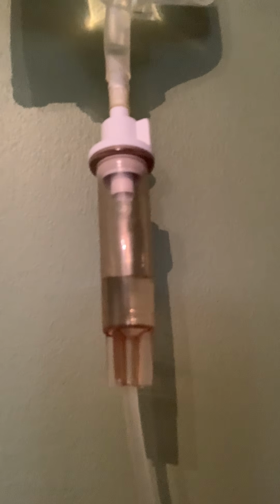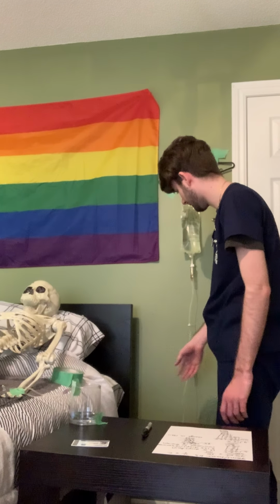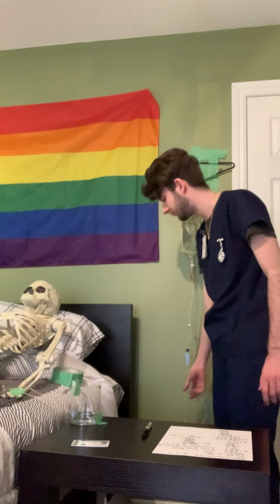I'm going to check the patency of the tubing all the way from the bag to the patient, making sure all the clamps are unlocked and that there are no air bubbles or any kinks or occlusions in the tubing. I'm also going to state the TBA, which is when the bag needs to be changed, which is in 13 hours. I'll check the insertion site on the patient.